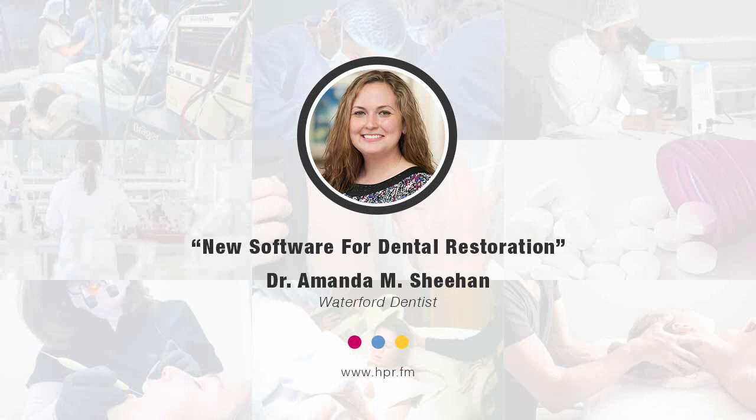And further, as people start to have some wear and changes in their teeth, we hear very often middle-aged people say, God, my teeth used to be so beautiful when I was in my 20s. My daughter, she has the exact smile just like mine. And we get what's called a smile donor. You can actually scan, it could be a family member, it could be a celebrity, and say, those are the teeth I want to have for my smile. And we can digitally grab their smile and use that in the presentation for the new patient. Wow. It's actually quite amazing because there's a lot of love for family members when a mother can have their daughter's smile or something like that.